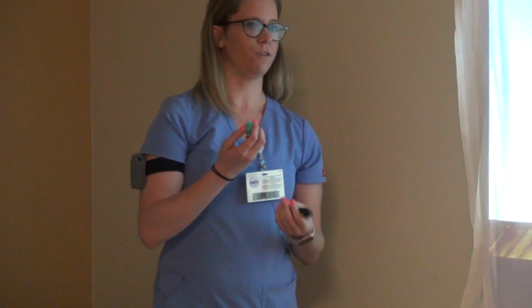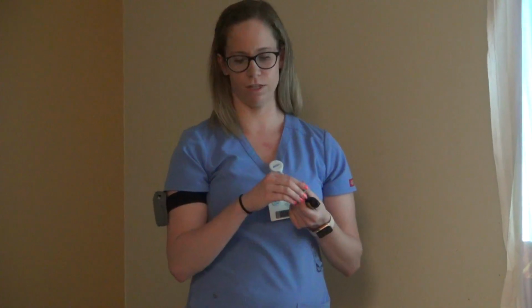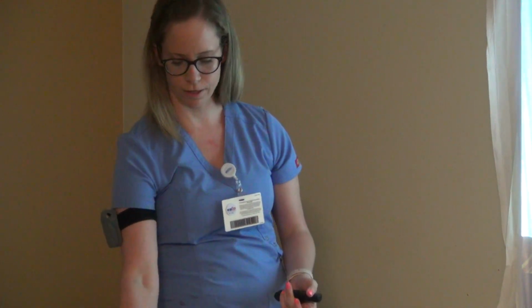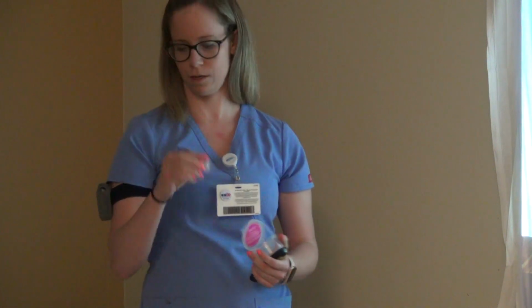When you use a Passy-Muir valve, you have to have the cuff deflated because even though they're inhaling through their trach, they're exhaling through their nose and their mouth. So if the cuff's inflated, they're not going to be able to exhale. So that helps them talk. And then we do have them too that you can put some oxygen on if they need it.